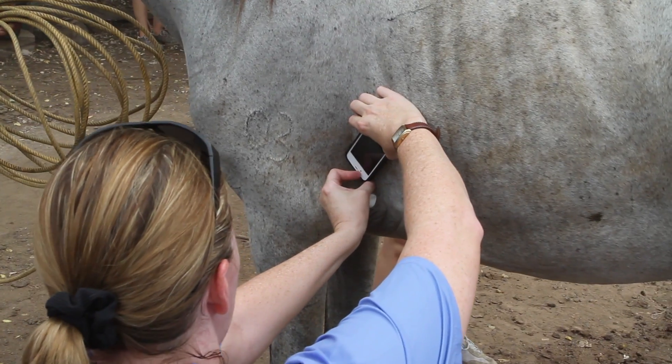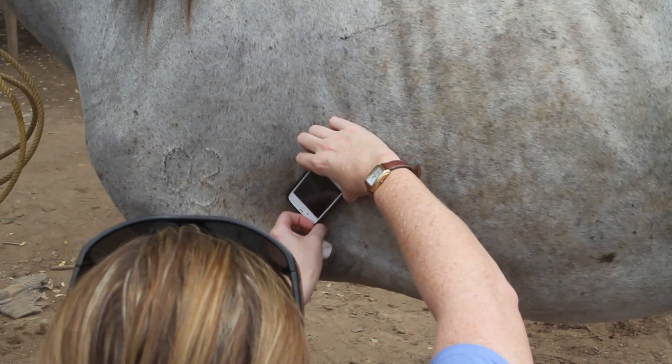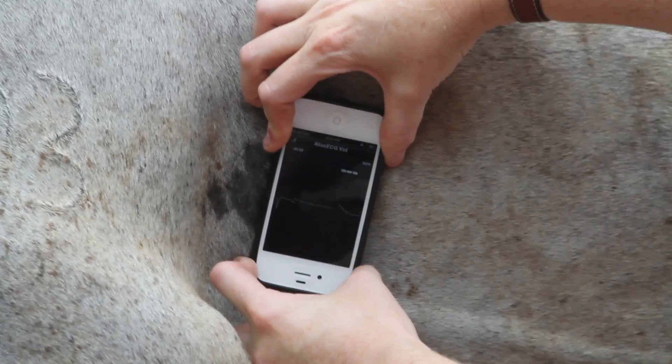This is the Alive ECG vet — I'm doing an ECG reading on this horse with my iPhone. Very cool.